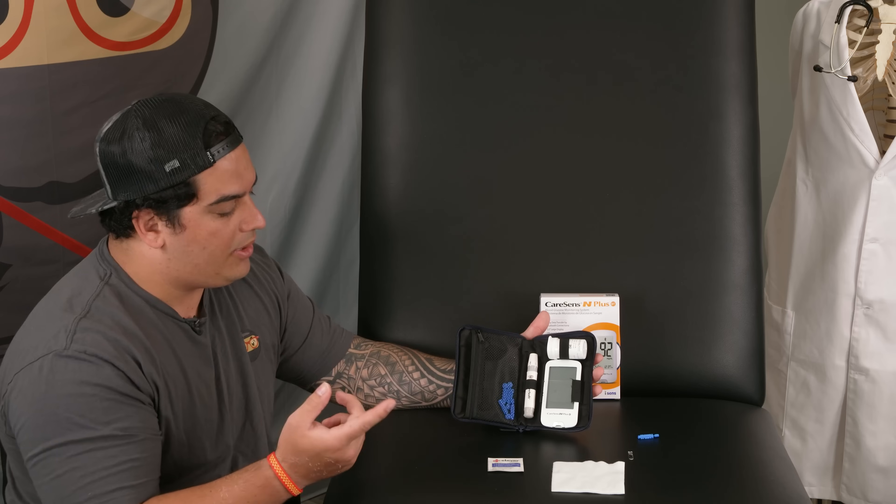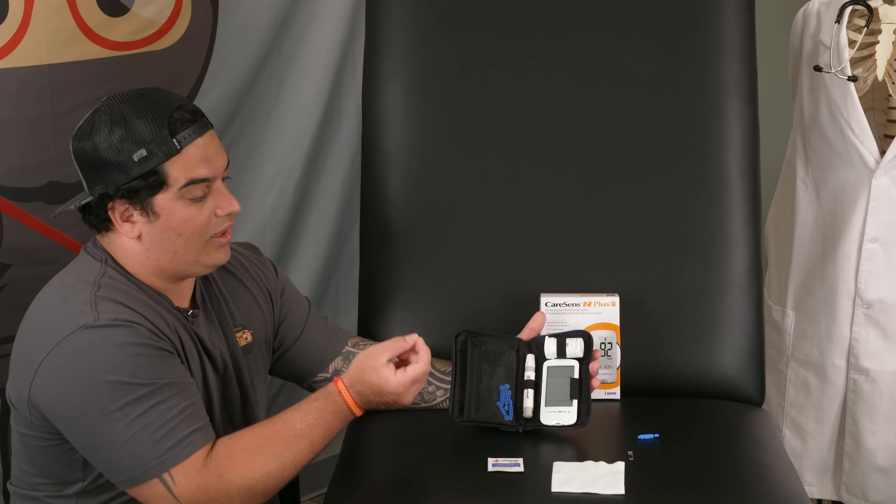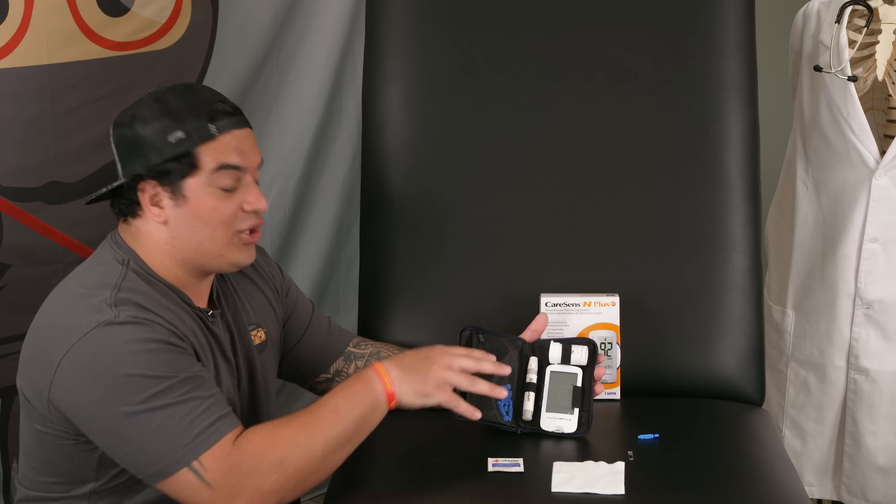Let's talk about all the different components that come within the CareSens N Plus glucometer kit. You have the lancet device, which delivers the actual skin prick. You also have the lancet itself, which goes into the device. Then you have the test strips, which collect the blood, and finally the monitor, which gives us the actual number we need.